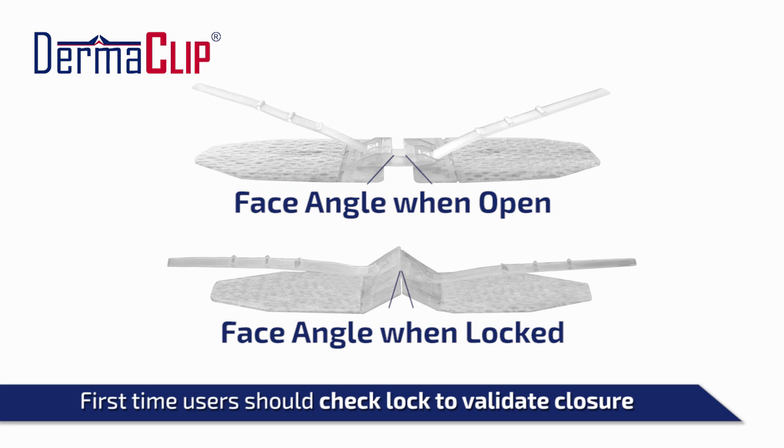Be careful. Novices with the device sometimes believe they have felt the click before the device is actually locked. To validate that the device is locked properly, give the tabs an additional solid but smooth pull and check to make sure that the faces are pressed firmly against each other in a near-vertical position.